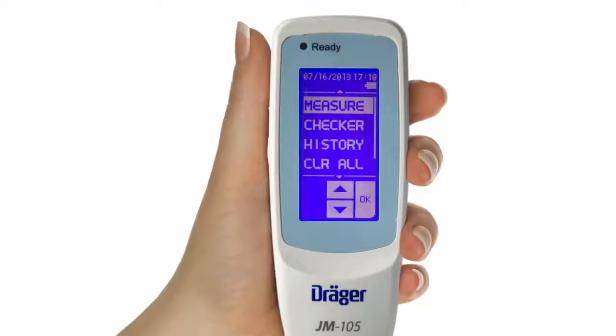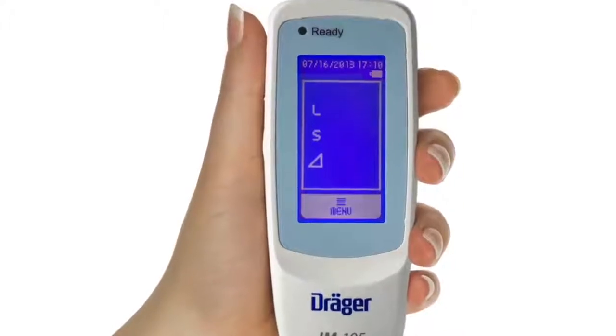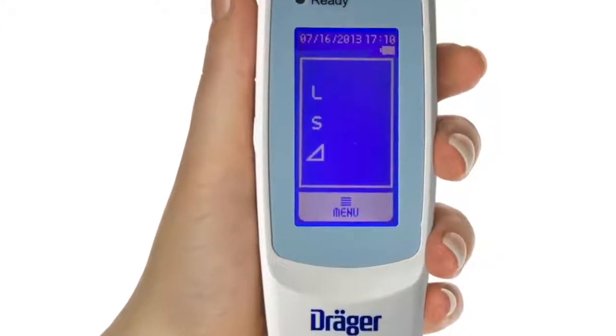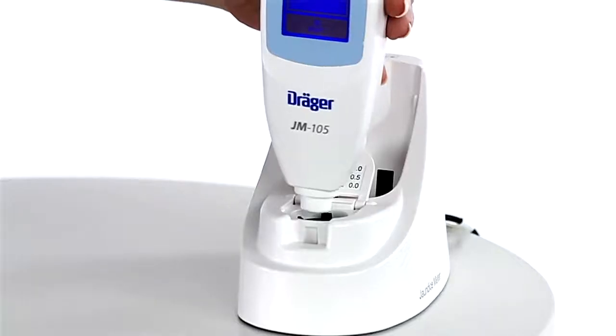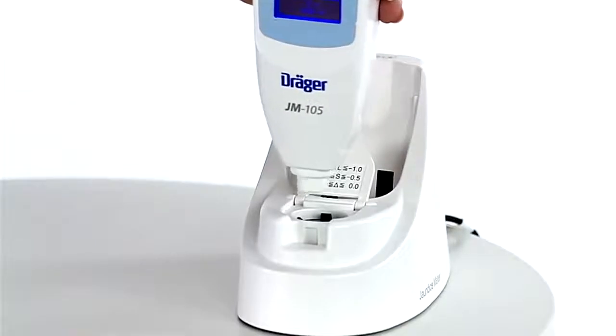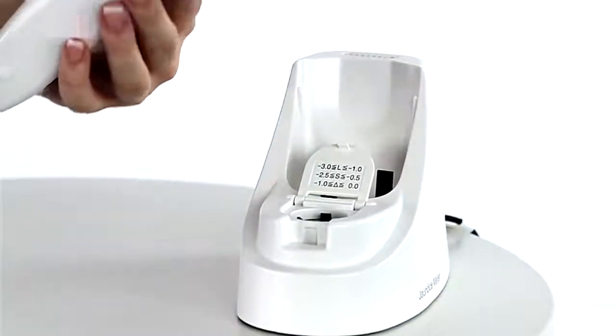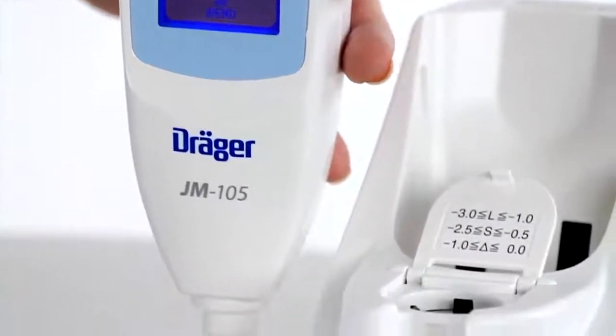On the main JM105 display, select Checker. The screen displays 3 vertical symbols, L, S, and delta, indicating that it is ready. Position the JM105 measuring probe perpendicularly on the surface of the checker. Gently press downward until a flash is emitted. Lift the JM105 and observe the display. Compare the values on the screen with the reference ranges.